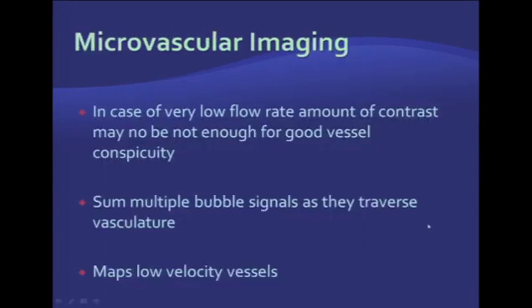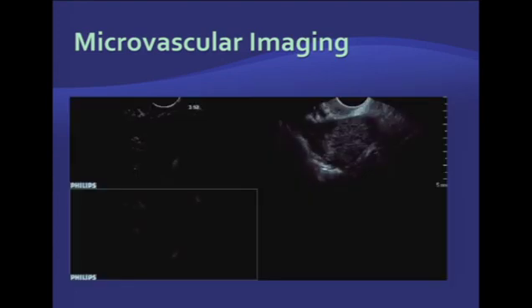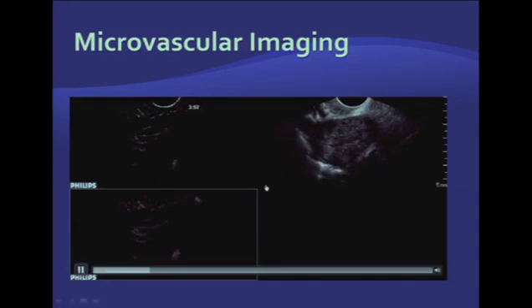Another helpful tool is microvascular imaging, which accumulates microbubble signals over time as they traverse the vasculature. It is a very helpful tool for lesions with very slow flow or very low levels of vascularity — like this benign fibroma in the ovary, a very slowly perfused tumor with very few vessels. Using this microvascular imaging technique, you can see microbubbles filling the entire volume of the tumor, providing nice delineation of tumor boundaries and potential quantification of blood flow.